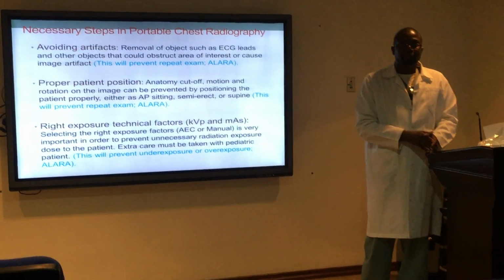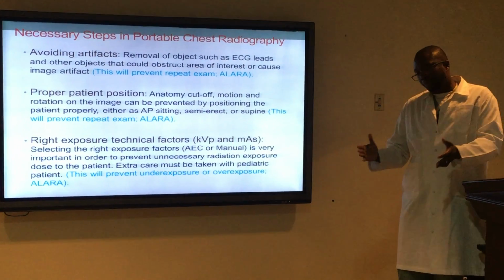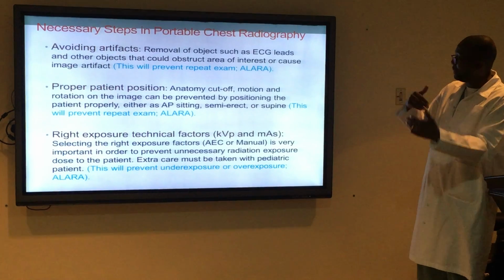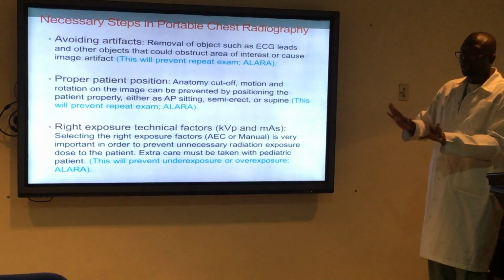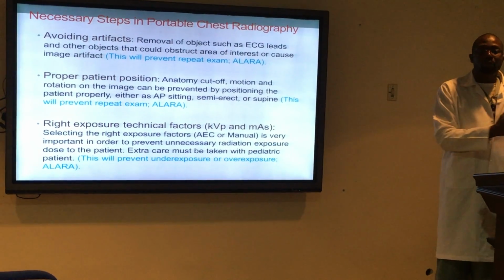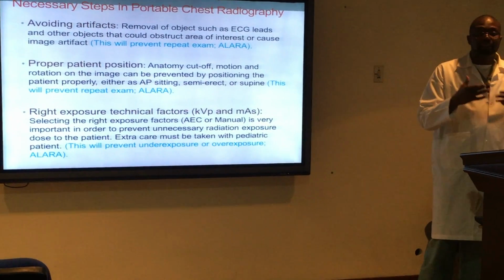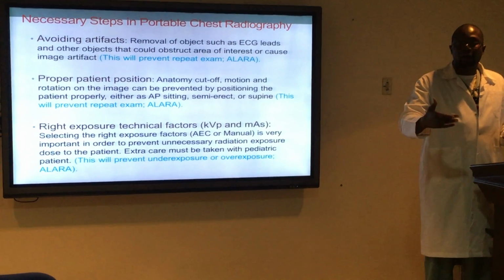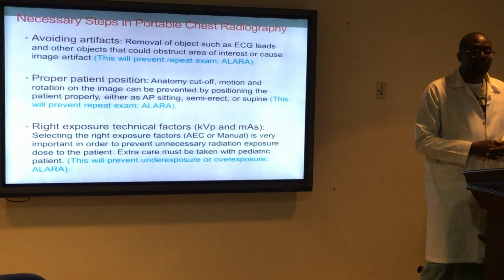You will prevent rotation, because whether you are doing your patient supine, semi-erect, or in an erect position, once the patient is properly positioned, then we will be able to prevent anything that might require us to repeat the exam.